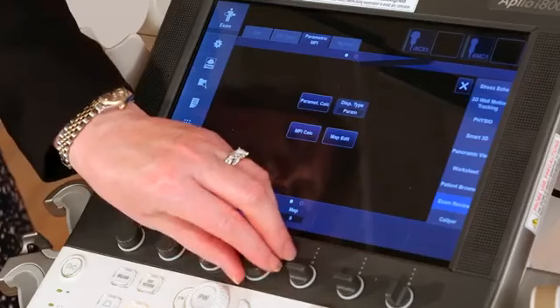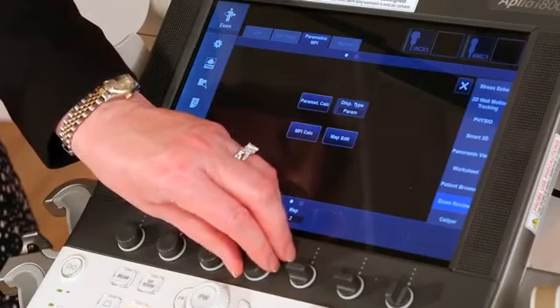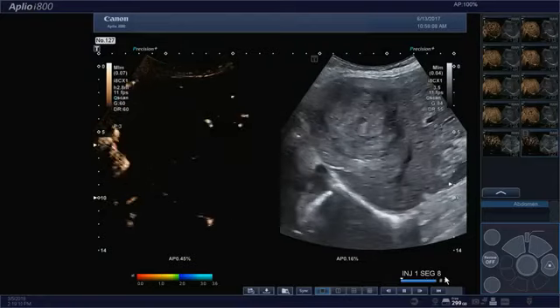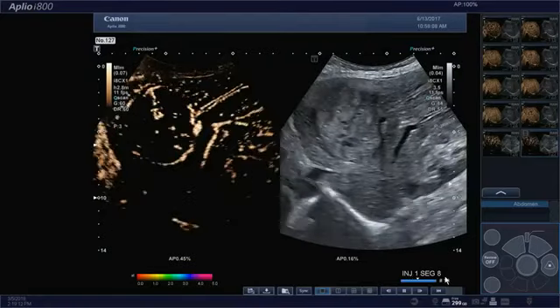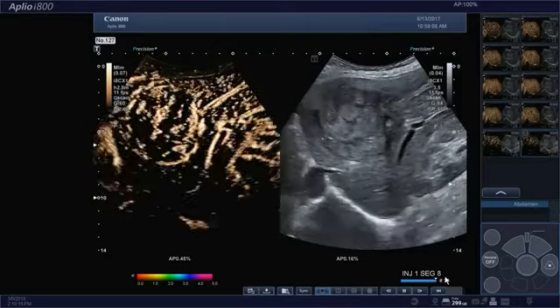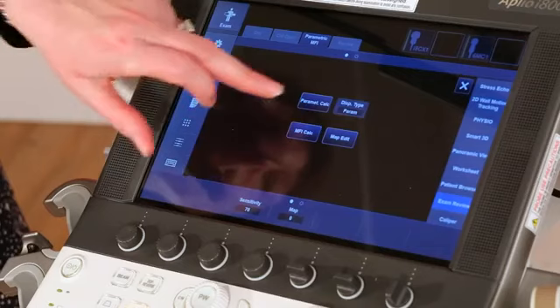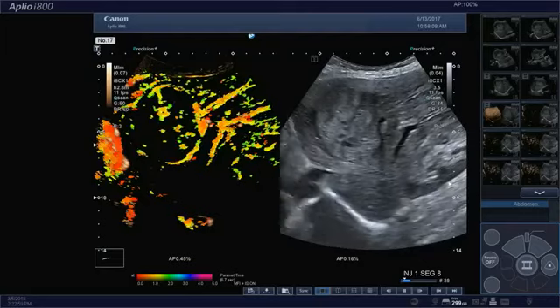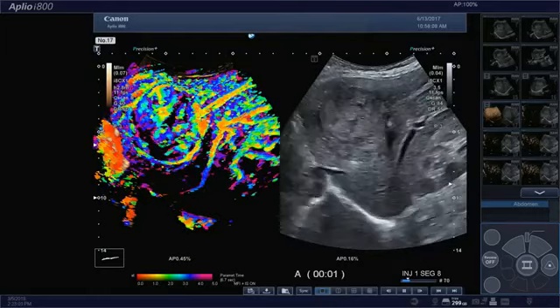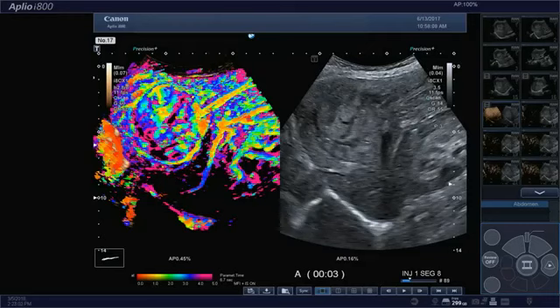And if you look on the monitor, this is the colour coding — you'll see that it goes from zero to five seconds. As I change the maps, you will see those colours change and you can choose to use one of those defaults if you want to. I'm going to leave it on the default. I've already selected the beginning and the end of the desired part of my clip, and then I'm going to simply press parametric calcs and you can see immediately that the system has colour coded the arrival time.